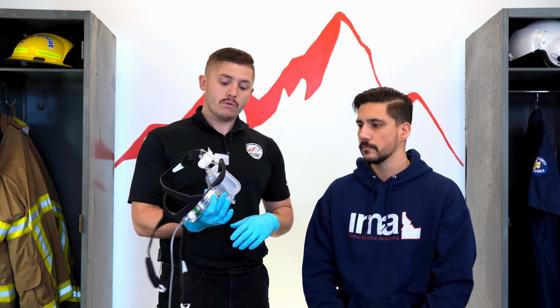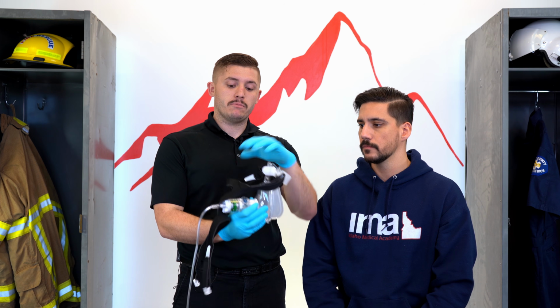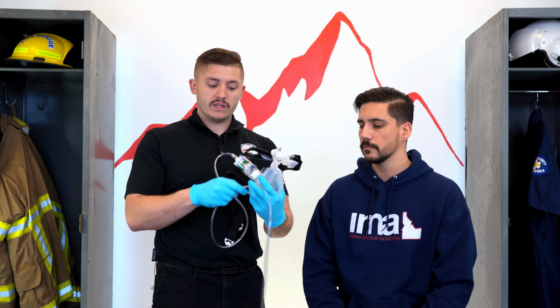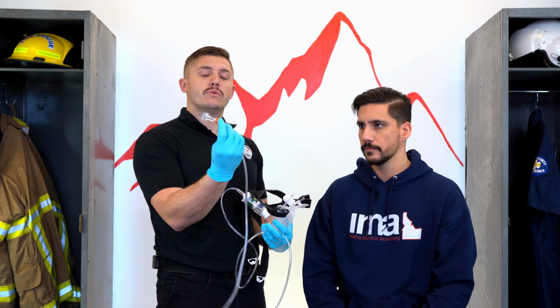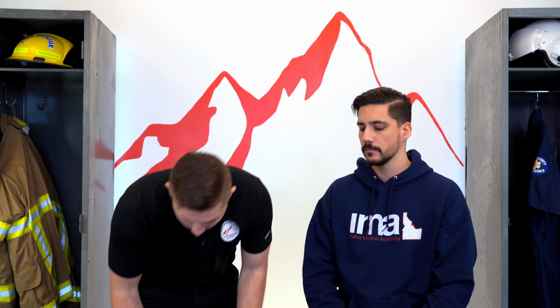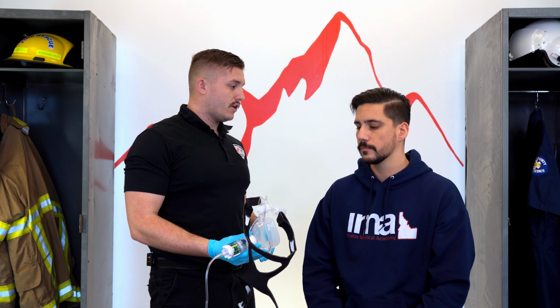So one thing we'll do, and I'll show you when I place it on Wade, is I'm going to place it on his face. I'm going to give some pressure. I'm going to have him take a couple deep breaths before I secure it, just so he can get used to it. But with these, they're really, really simple. On the other end is just normal oxygen tubing. We're going to place it on our oxygen, and it tells you what to flow it at. So for this one specifically, it's 10 liters per minute. I'm going to place it on my oxygen regulator. Put it at 10. Okay, Wade, I'm going to place this on your face.